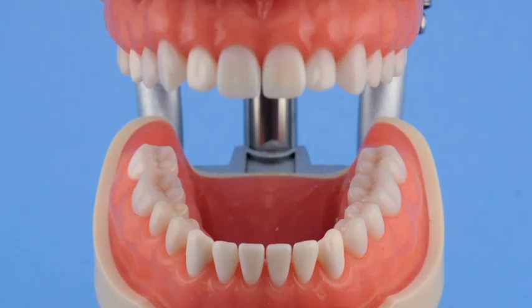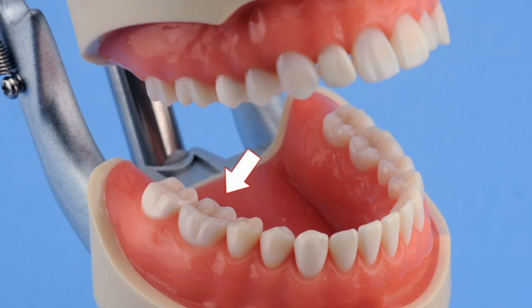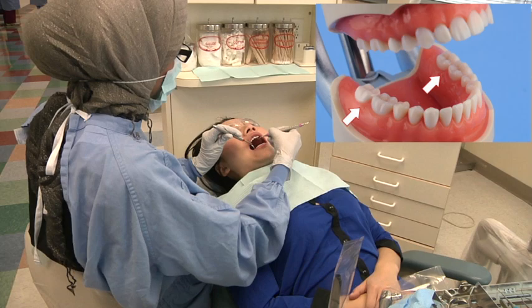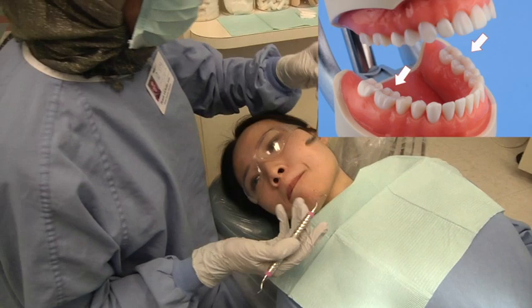Therefore, the right facial aspects and the left lingual aspects will be facing towards you, while the right lingual aspects and the left facial aspects will be facing away from you. All posterior aspects facing towards you should be treated while you assume the 9 o'clock position, and all posterior aspects facing away from you should be treated while you assume the 10 to 11 o'clock position.